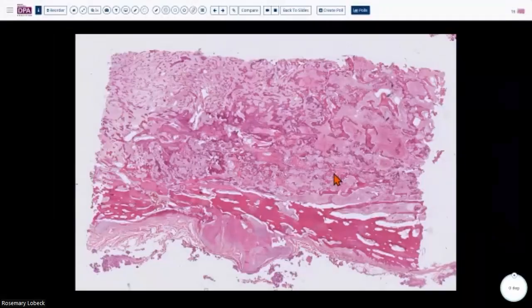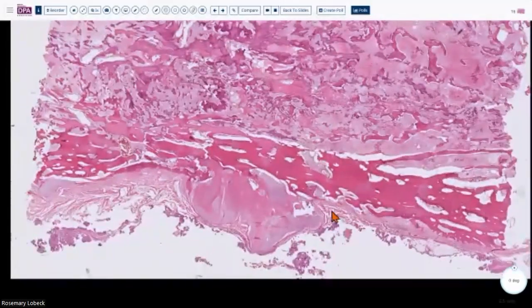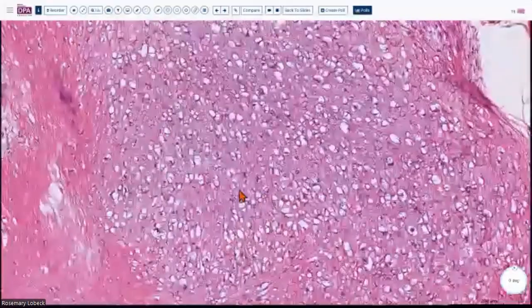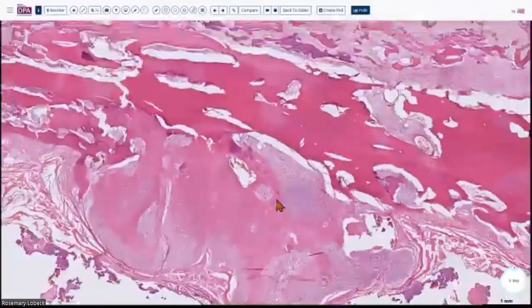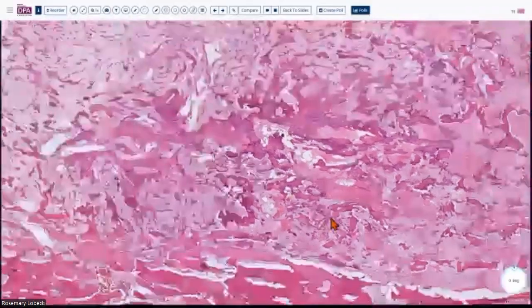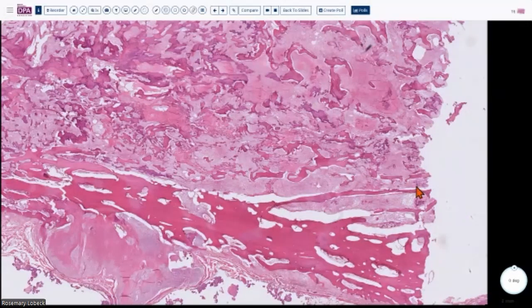So I will show you an example from another patient of a related tumor, which is basically a low-grade osteosarcoma. Parosteal osteosarcoma has the same genomic and morphologic features as a central low-grade osteosarcoma. So this is a central low-grade osteosarcoma. Here, you can see there is a bony outgrowth coming out, and you can see the same type of cartilaginous material, like a cartilaginous cap, and irregular formation without lobulations here, right? And then you go into the center of this lesion, and all the marrow is gone. Obviously, the bony proliferation is highly abnormal. A couple of points that you want to notice here is these long parallel trabeculae of well-formed bone, right?